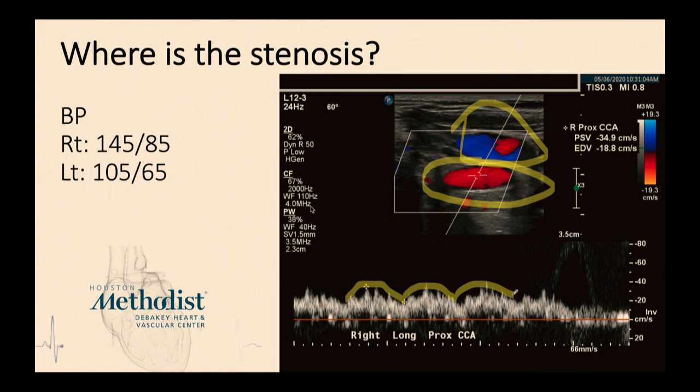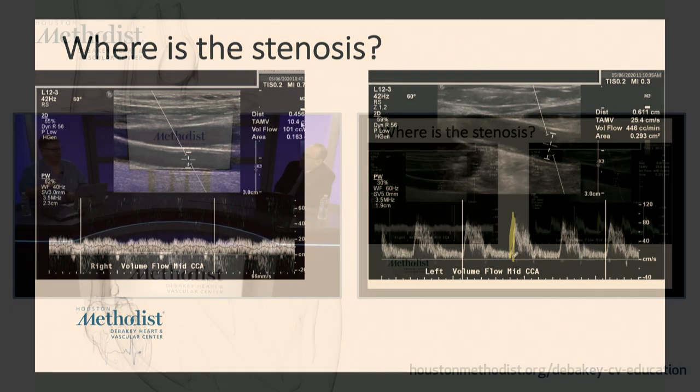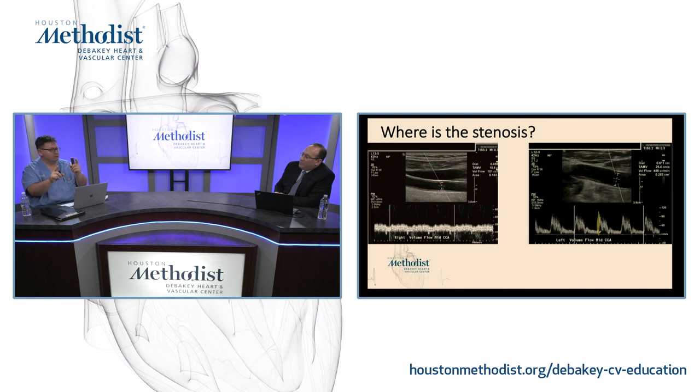Yeah. So we're going back to one of my favorite teaching points. As you mentioned, when you see a systolic upstroke between your measurement point and the heart, definitely there's no obstruction. That missing systolic upstroke alerts you that there's definitely a stenosis between your measurement point and the heart. And then you start thinking, I need to go proximal. So I'm in a proximal right CCA, let's go proximal. And the good answer, what I was looking for, either an innominate stenosis versus a right proximal CCA stenosis.